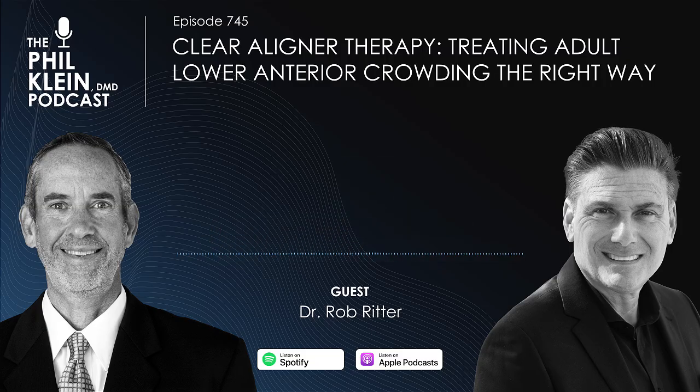There are two ways to do this. I think after a while, you can look at a scan yourself and say, I can do this in-house, or it needs to be sent out. With Invisalign, and I can only speak to Invisalign because that's what I utilize in my practice because of the iTero scanners that we have, you can send that out for a quick diagnosis, where it takes about 2 minutes and comes back with a proposal to show you and the patient what could potentially be the endpoint.